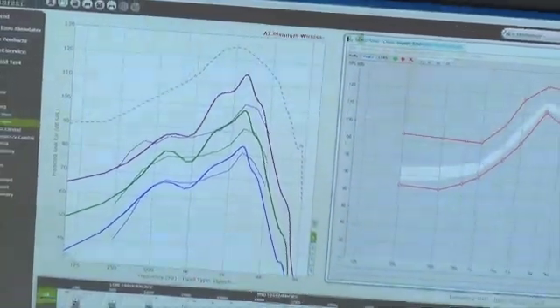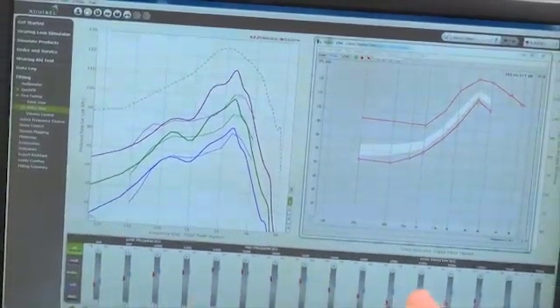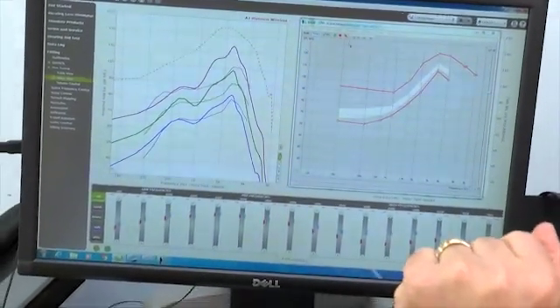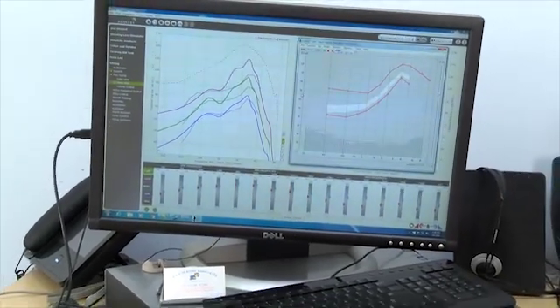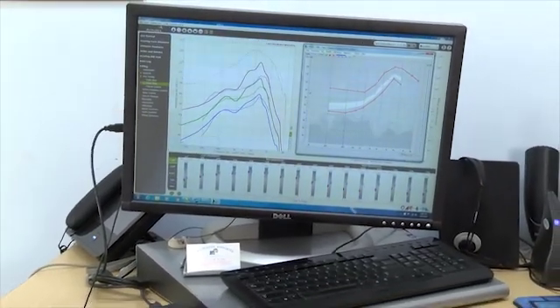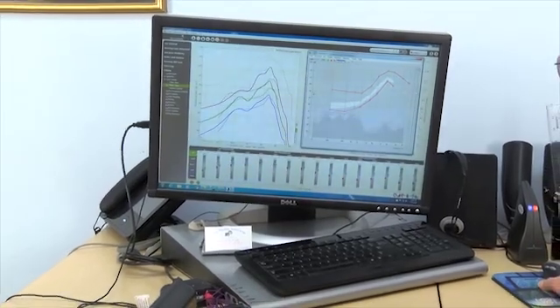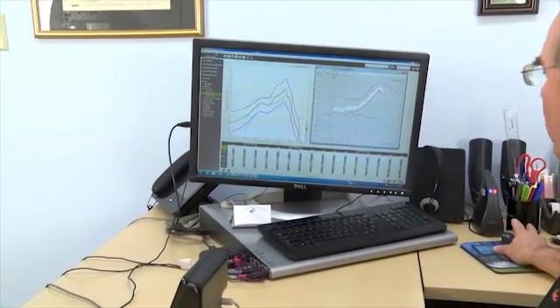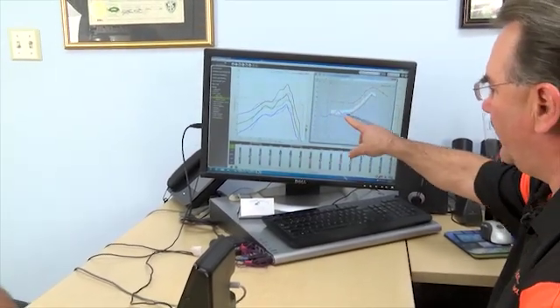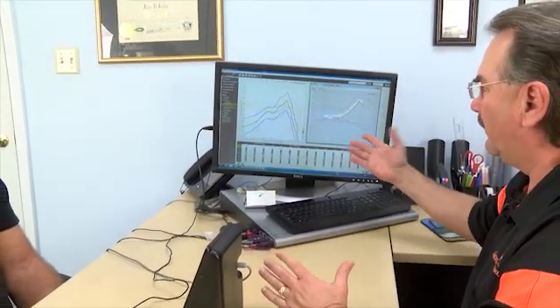And now the hearing aid is in there with the probe mic. So as the sound comes into the microphone, goes into his ear canal, the probe mic picks it up and sends it via the wire back to my diagnostic analyzer. So now Tim's hearing aids are turned off. We muted his hearing aids. So we're going to turn this on.